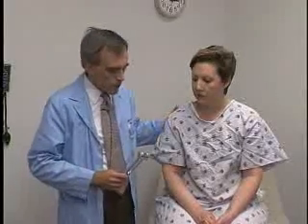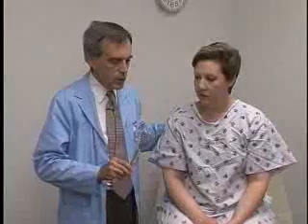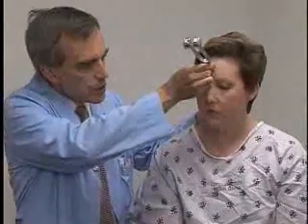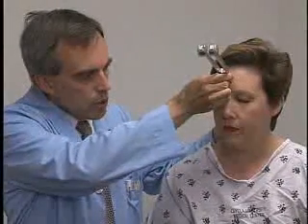I'm going to have you tell me how you're hearing or feeling the sound or the vibration from my tuning fork. I'm going to put it on your forehead. Close your eyes, and I'm going to put the vibrating tuning fork over the center of your forehead. Can you tell me, do you feel it more on the left or the right, or both? Both. So it's both — and that'd be the normal response for the Weber test.